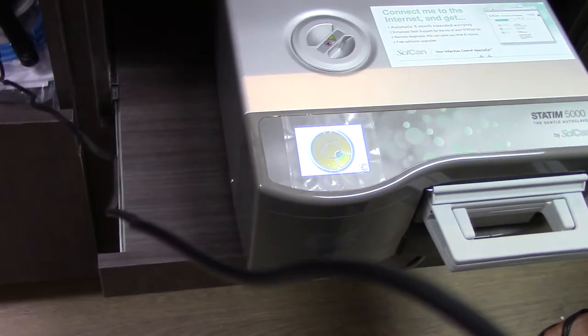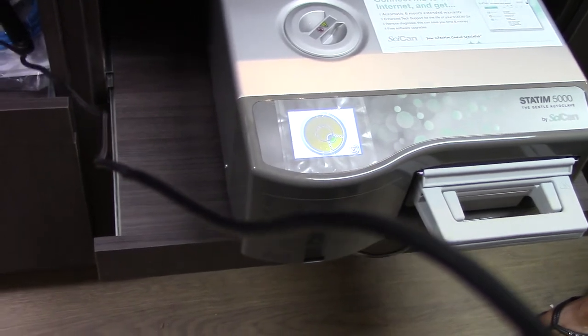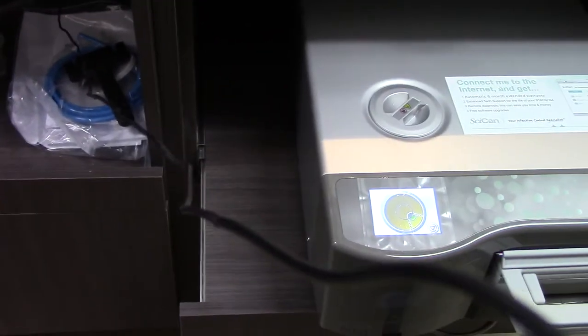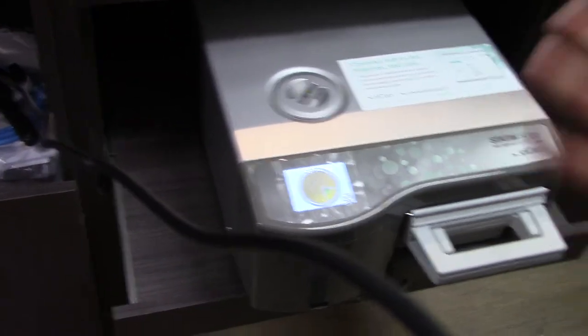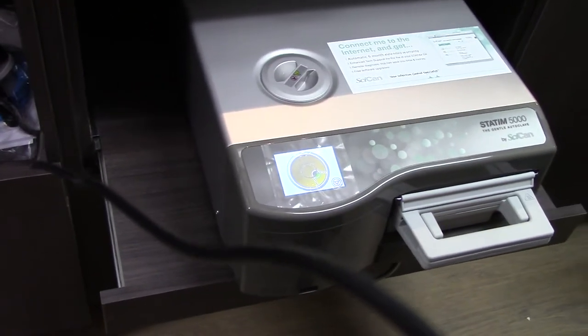Okay. I would say if you want it to come out as dry as in the Bravo, it's going to take about 24 minutes. But this is more designed for quick cycles, for hand pieces, to get stuff off the cutters quicker. I do have a lot of offices that strictly use this, but they'll let it stand there longer to dry.